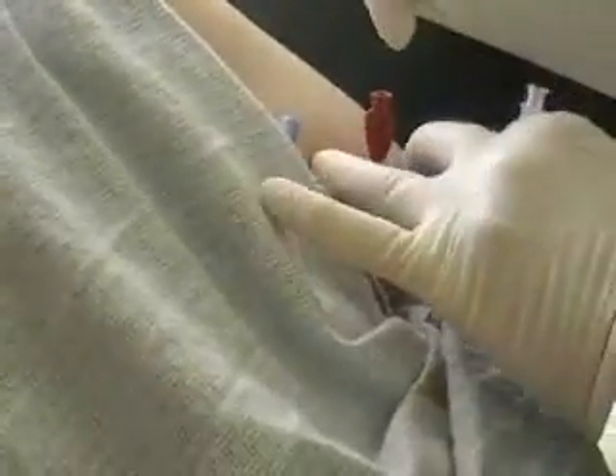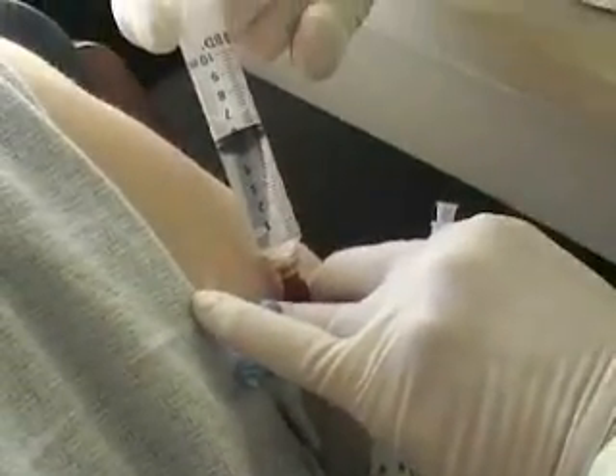I'm going to take off the little cloth. I don't have enough pads. I'm flushing with 5 cc's of normal saline.